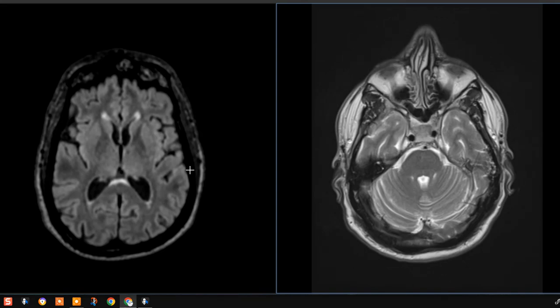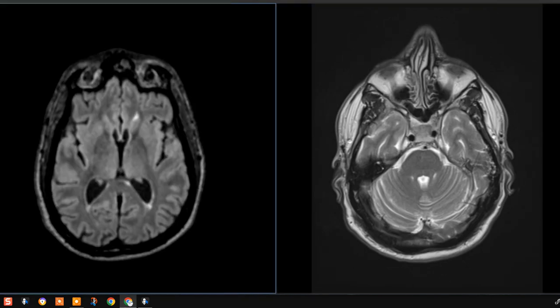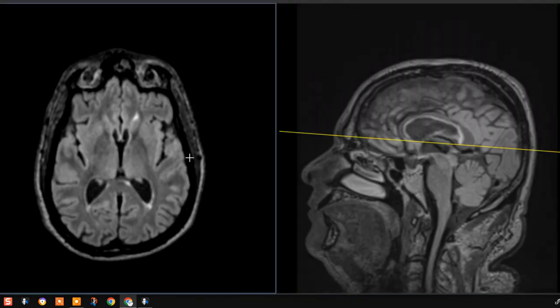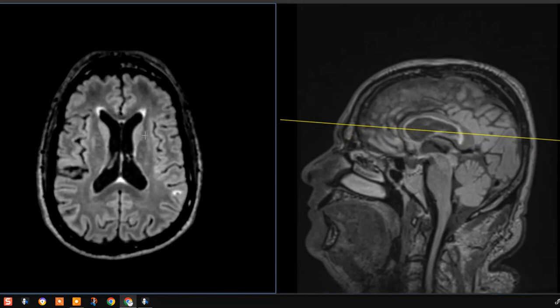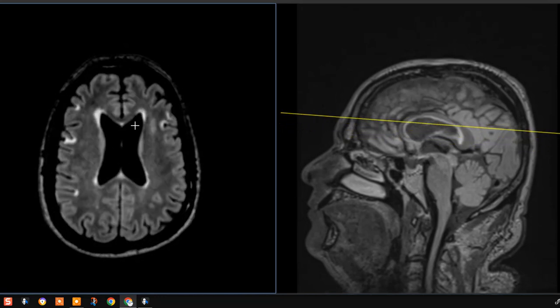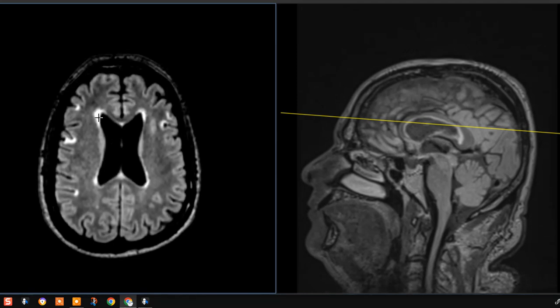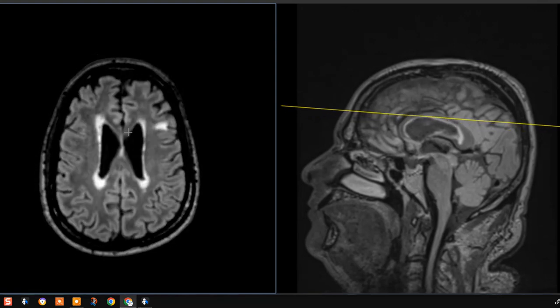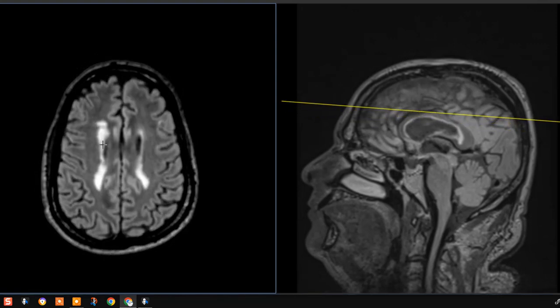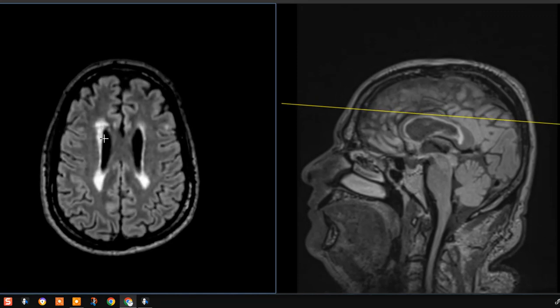Now the patient has another finding, and that's really why I'm showing this video — they have demyelinating plaque. If we scroll up we see the left lateral ventricle, right lateral ventricle, and we see around the rim of the ventricle bright signal. This is demyelinating plaque that hugs the ventricles — we call this the pericallosal white matter or deep periventricular white matter.